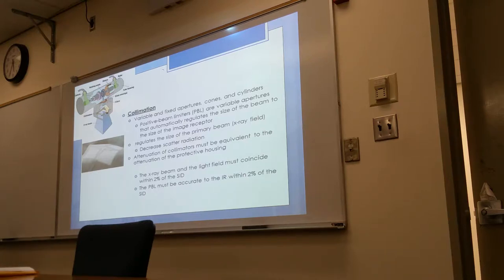What are the collimators made of? Lead. Okay, is it composed of lead? Aluminum. Okay. They're composed of lead. Okay. Thought I had that right.